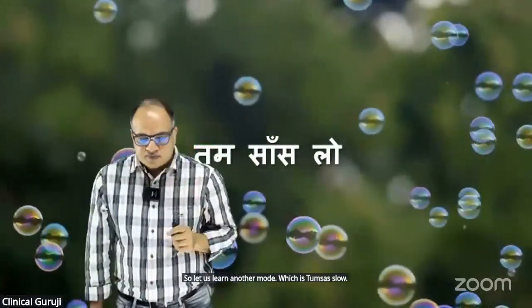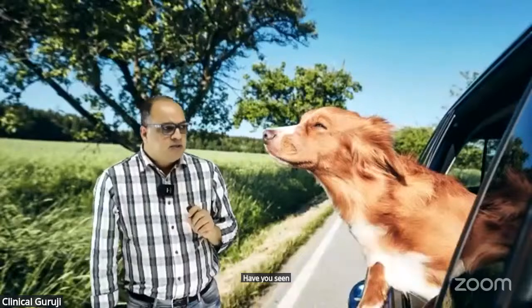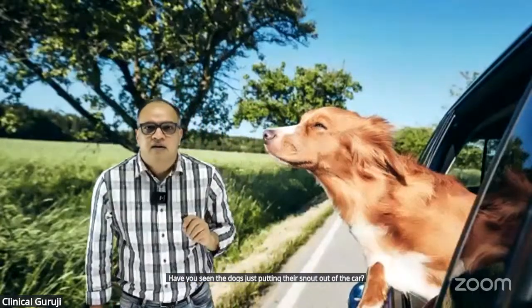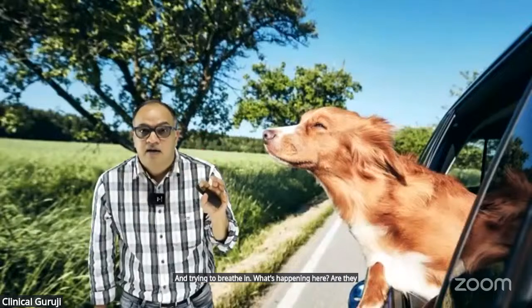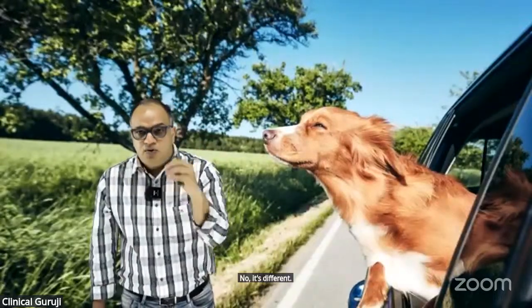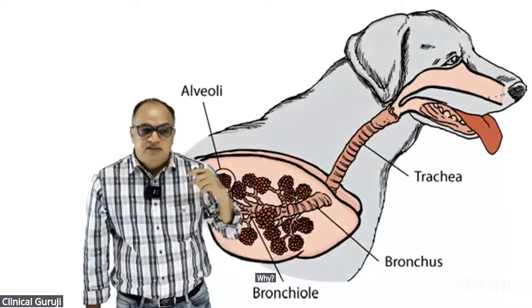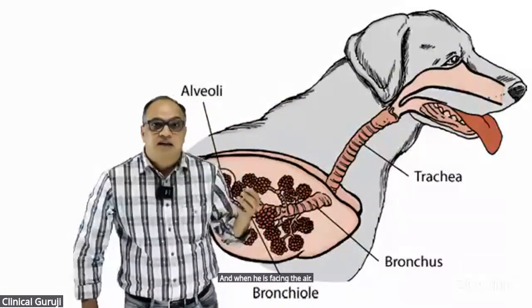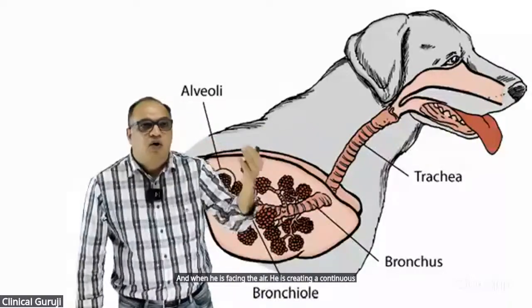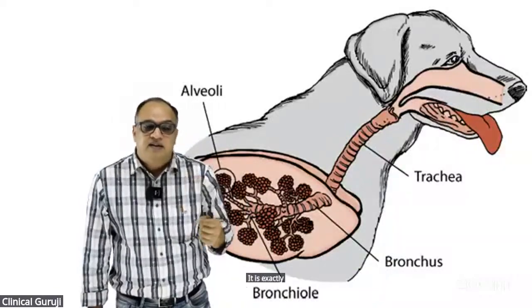Some of you might have dogs in your homes and some of you might be taking those dogs along when moving in cars. Have you seen the dogs just putting their snout out of the car and trying to breathe in? What's happening here? Are they liking the air? No, it's different. The dog doesn't want to sit inside the cabin. He wants to put his snout out. Why? Because the dog has a very high upper airway resistance. And when he's facing the air, he's creating a continuous pressure of air on his snout, which is helping him breathe. It is exactly like a ventilator mode.